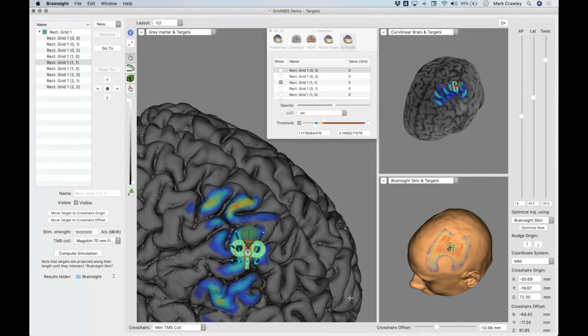Here's another lovely question for you now, Mark. Do you have any plan to include coil definition files for DeyMed coils, air cooled or the standard coil? Yes, we do. We're working on it, and it'll be in there as soon as we can get it done. But yeah, it's fantastic. The world is a better place.